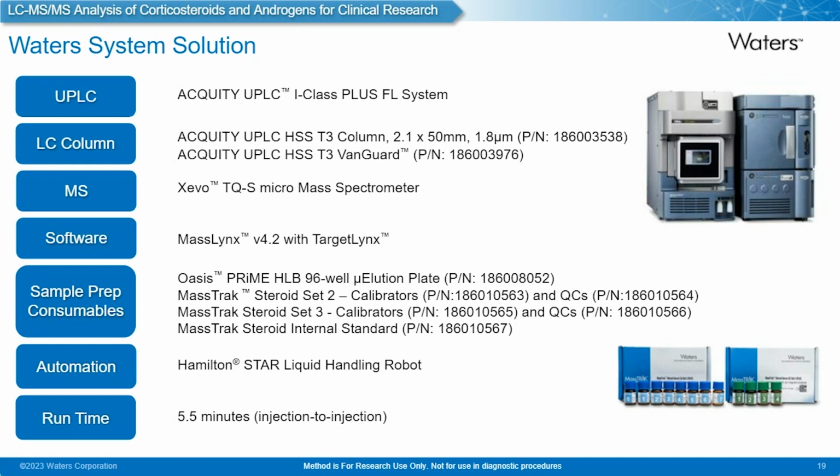And we're able to adopt that sample preparation to perform separation on the Acquity UPLC I-Class Plus FL system, with separation on the HSS T3 column with T3 VanGuard, and detection on the TQS Micro mass spectrometer. The runtime for this is 5.5 minutes injection to injection.